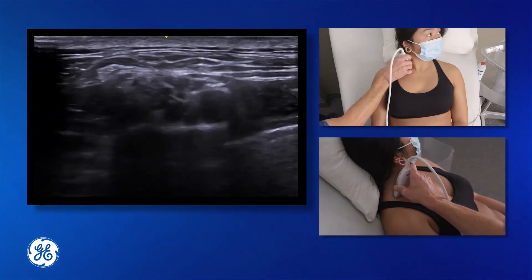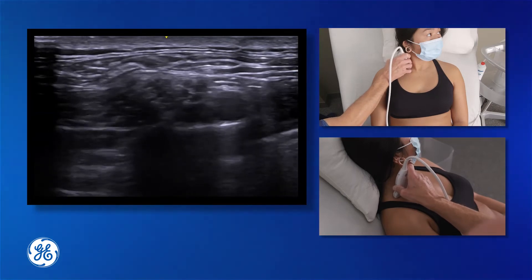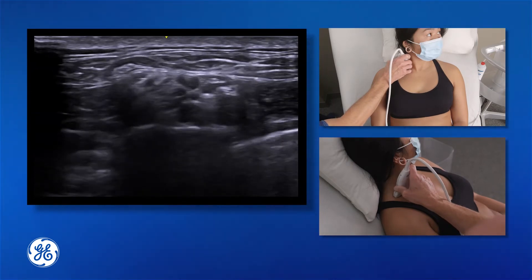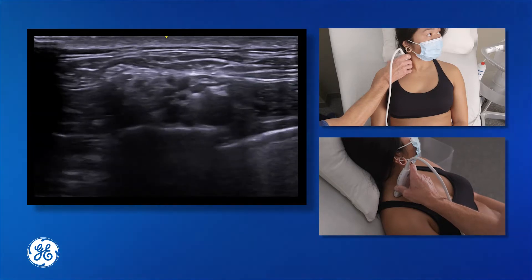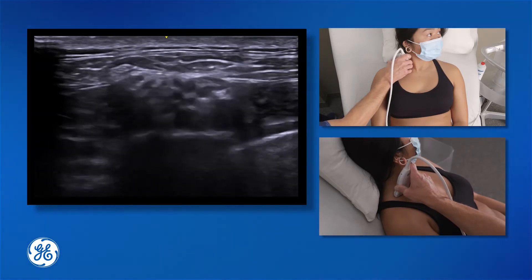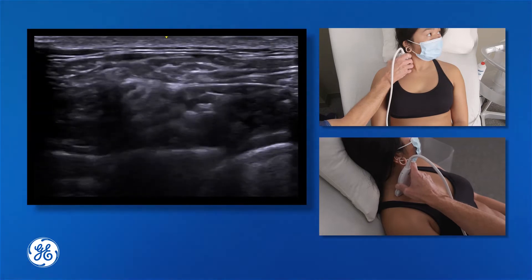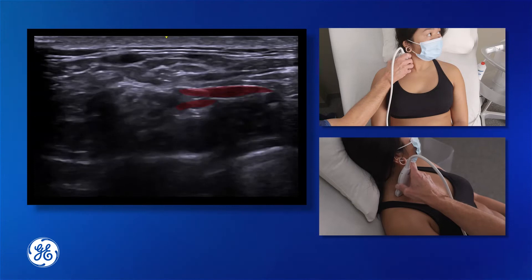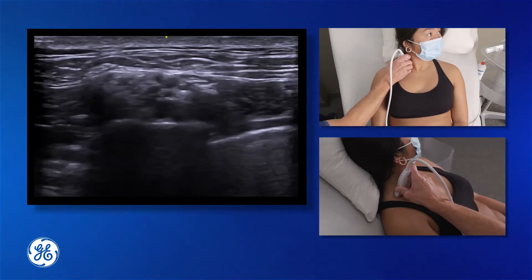It's very important to use colour Doppler on this screen. By taking pressure on and off we can see vessels running through the plexus — quite often the dorsal scapular artery, transverse cervical artery, or the suprascapular artery passing through the plexus, as well as other vessel branches. As I take my pressure off, we can see a little vessel on the medial side of the plexus opening and closing up, so it's important to use colour Doppler in this region.